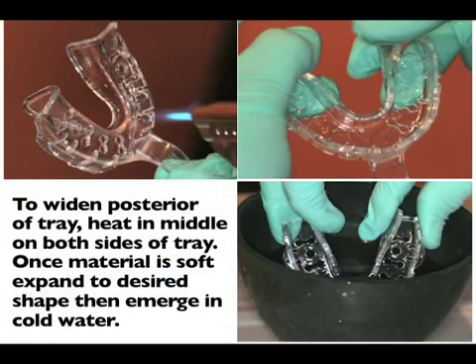This particular implant case, as you may have noticed, the posterior arch is wider, and this is generally because the patient has been missing posterior teeth for a long time and the ridge has resorbed down and out, and generally you will see these cases are wider in back than in the anterior segment. Of course, we have 3 sizes of trays. However, they may not fit every single arch configuration.